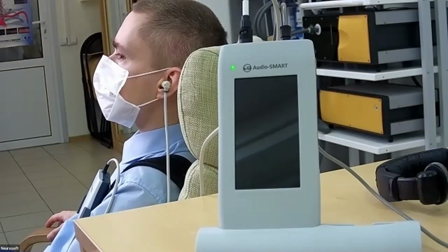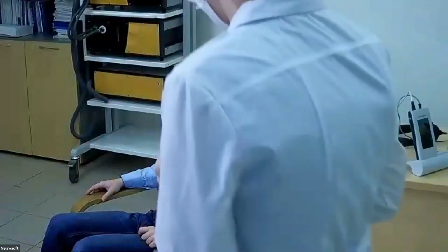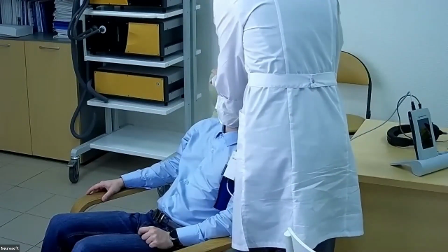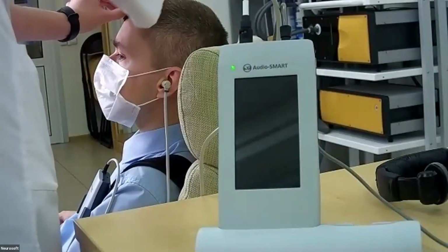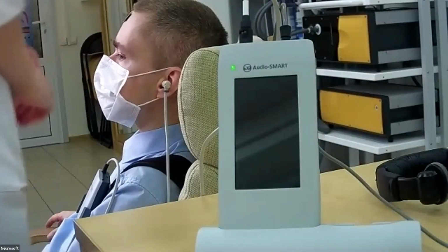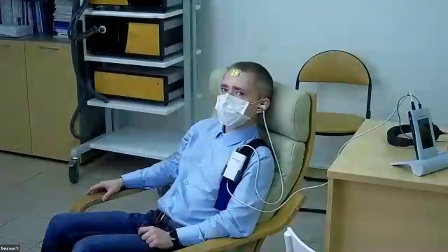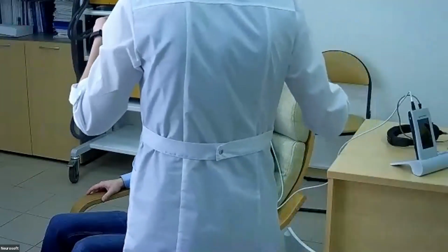We will use hydrogel electrodes today, but you can also use other types of electrodes, for example, cup electrodes if you want, because they also have touch-proof connectors which can be connected to the adapter.